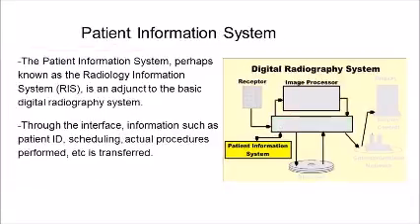The Patient Information System, perhaps known as the Radiology Information System, RIS, is an adjunct to the basic digital radiography system. Through the interface, information such as patient ID, scheduling, actual procedures performed, etc. is transferred.